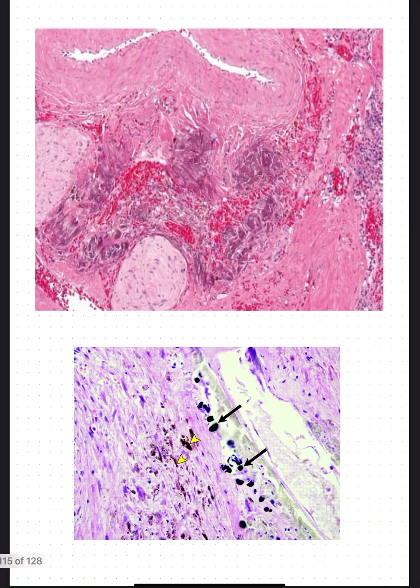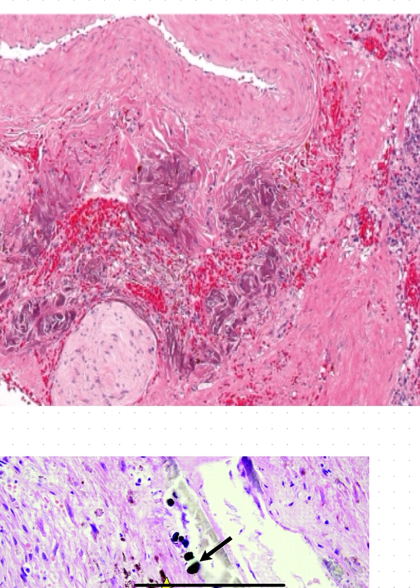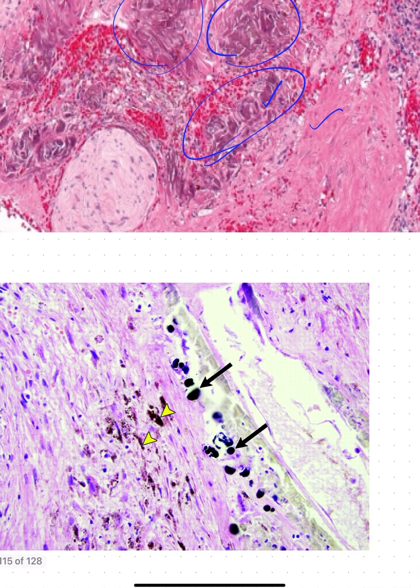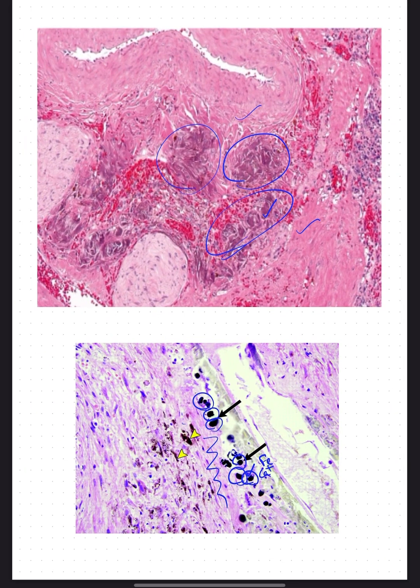Coming to the microscopic findings, we see splenic tissue. There is extensive fibrous tissue, and within the fibrous tissue, we find brown pigment deposition. These are nothing but the Gamna-Gandy bodies. This is hemosiderin pigment deposition. Another image showing you the dark brown, darkly stained Gamna-Gandy bodies. They contain hemosiderin pigment deposition along with calcium and iron, and there is extensive fibrosis around them within the tissue. This is extensive fibrous tissue within the spleen.